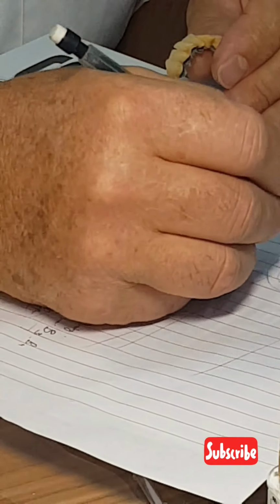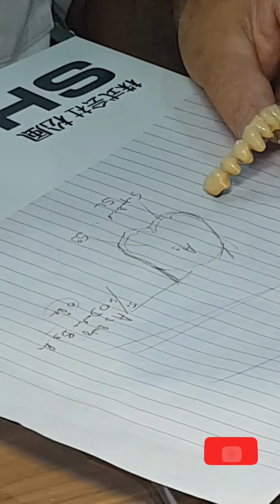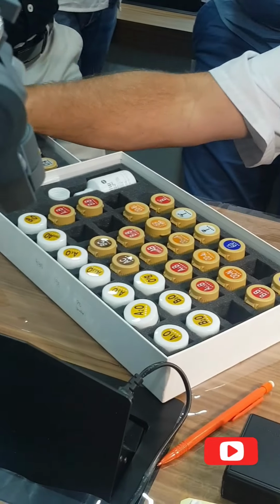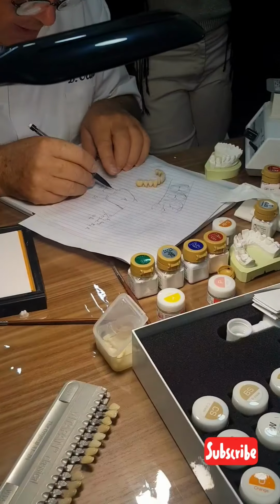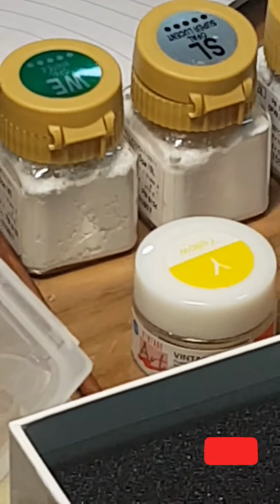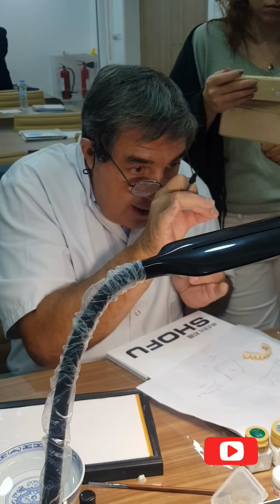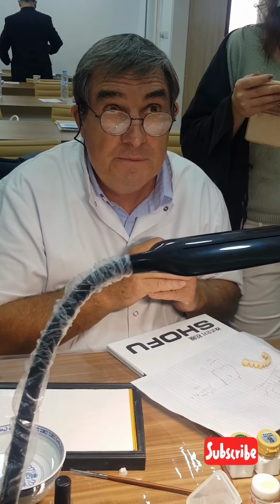If I want, for example, to have a more whitish crest, you know, very often it's very nice. It's very simple. We have the product, white effect. That means that at the final step, it's enamel, so I will finish all the crest with a more whitish effect.